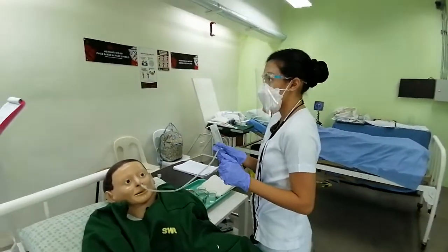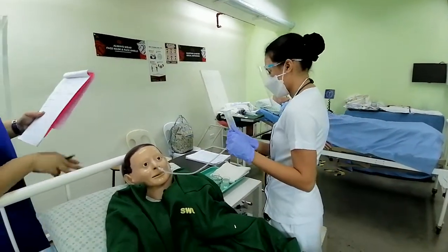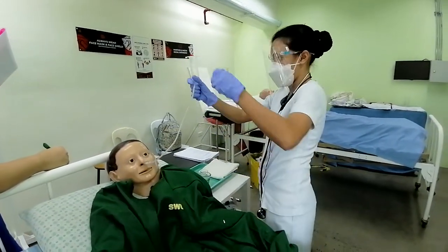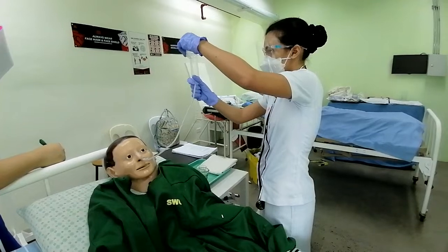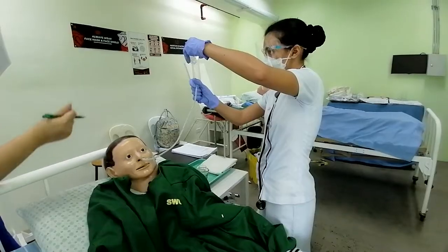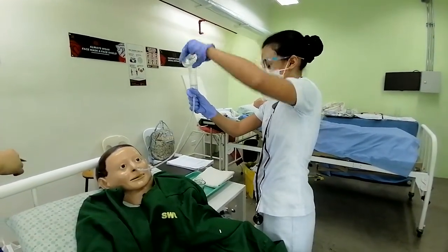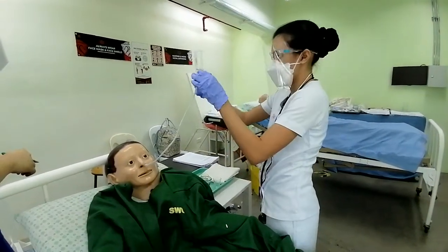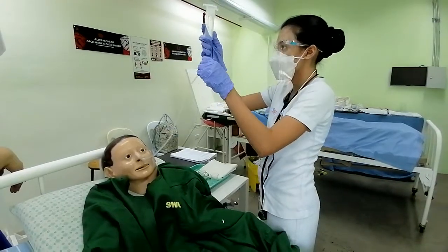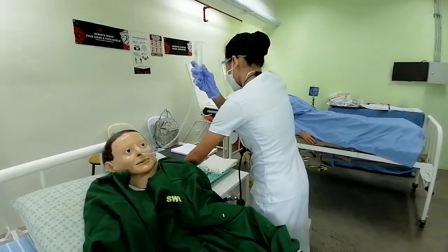After that, go now to irrigation. After that, I will irrigate with water. The purpose? No spilling. Then fill in directly. And then start feeding.